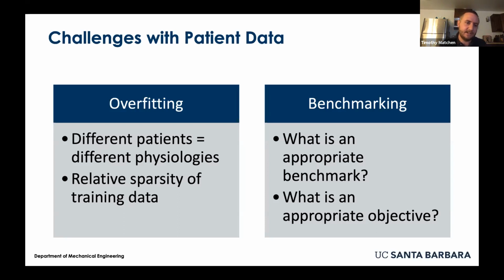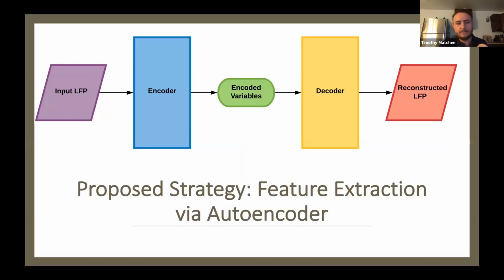And the way that we decided to go about solving this was by using an autoencoder, which is a specific type of neural network. Now, the idea behind an autoencoder is that we extract key features of the network by trying to reconstruct the original signal, but passing it through a bottleneck, where you only have maybe 2 to 3 outputs for one of the layers of your network, which essentially projects the original data onto a smaller space mapping.